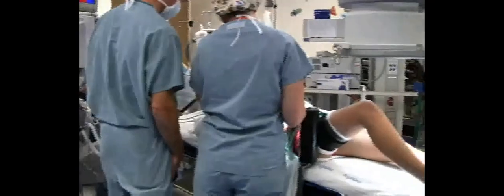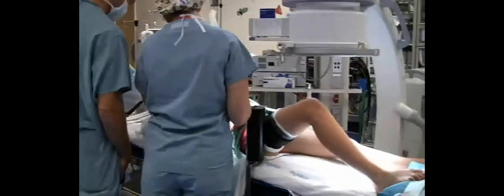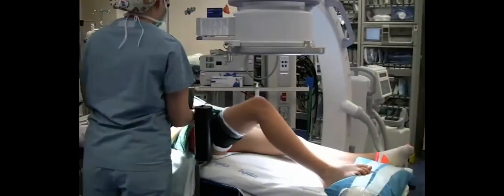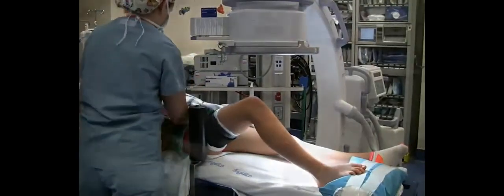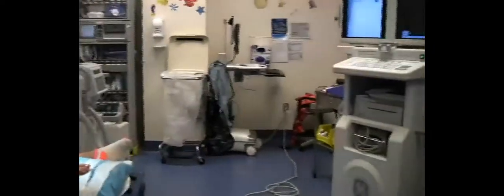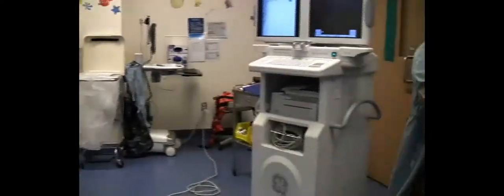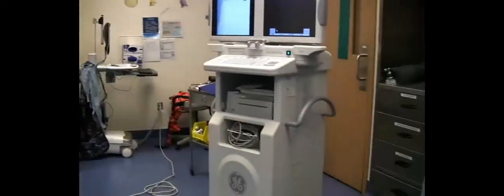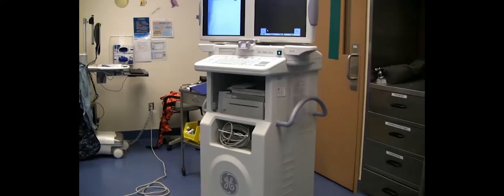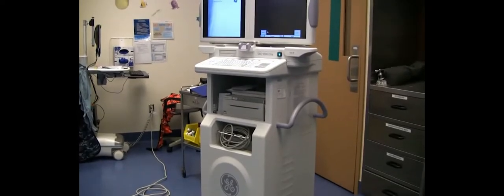The patient is placed supine on the radiolucent OR table with a beanbag and thigh post holding the leg in approximately 45 degrees of flexion. The fluoroscopy monitor is placed at the foot of the table to facilitate viewing.